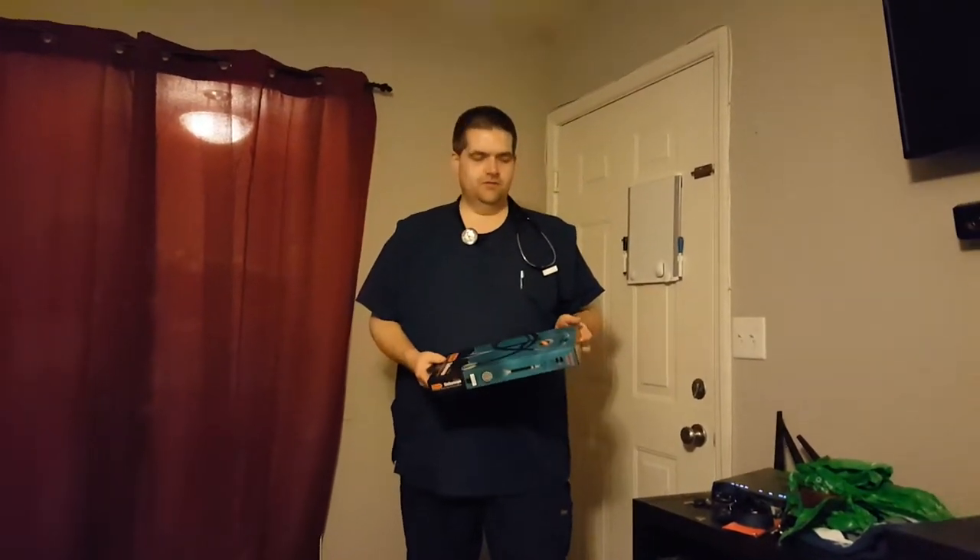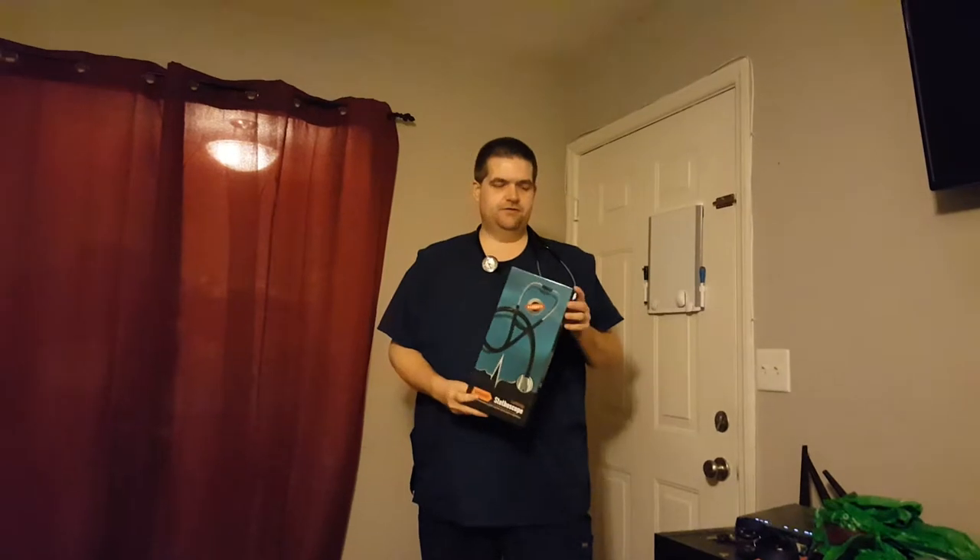Hi, I'm Ryan with Simply Cheryl, coming to you today to talk to you about the new cardiology stethoscope here from Voifroid.